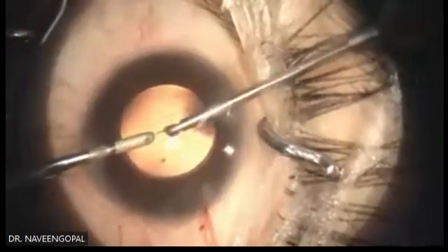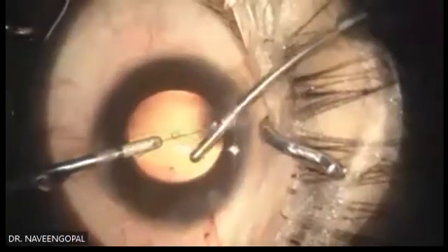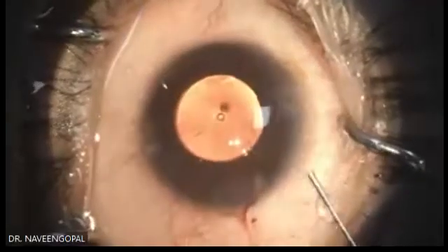ICL, it is a completely different ball game. The loading is different, loading system is different. Yeah, we are done, I think. Now the only thing which is left is to close the AC.